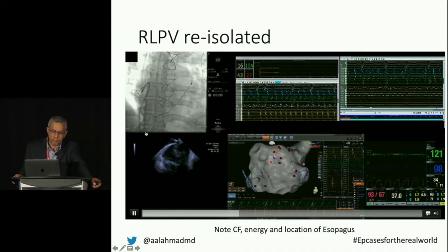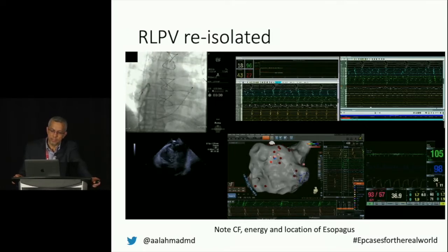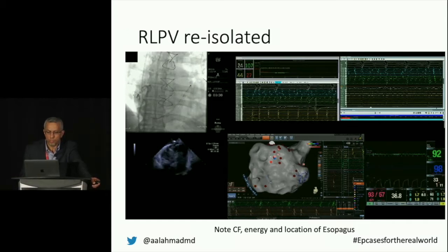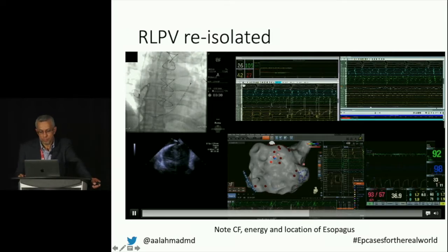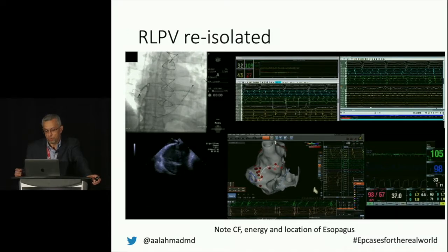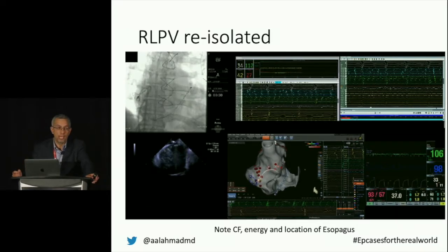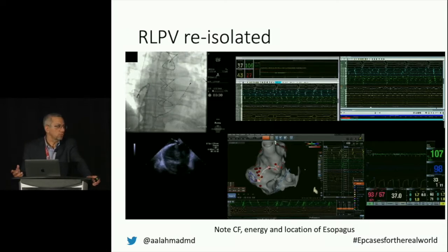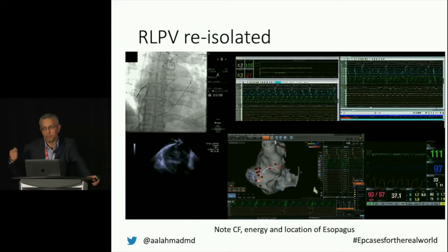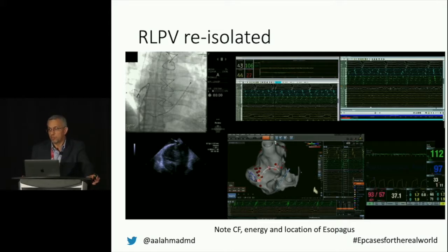As we monitor the esophagus, you can see it a lot on ICE and have to maintain short duration. So if you look at the output, we're at 44 watts. So we're at reasonably high power. You just have to make sure of a couple things. One, you make sure that the contact force is not too high. So when you're going at about 44 watts, we try to stay in a contact force range of 5 to 10 grams. You don't really need 10 to 20 grams in that high power mode. And then also the time that you spend in a location should be modulated if you're going at that high output.